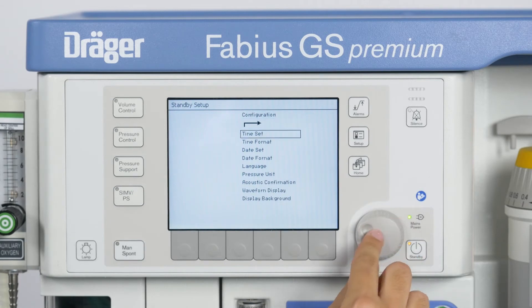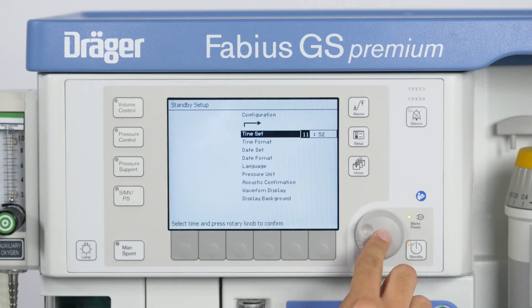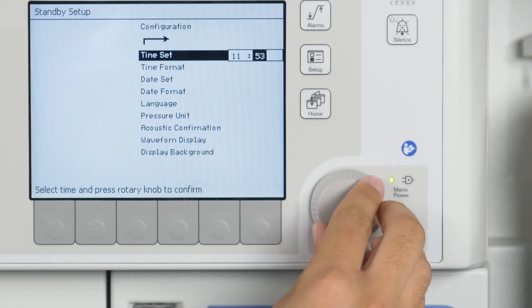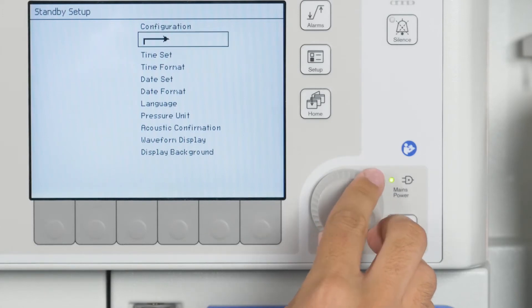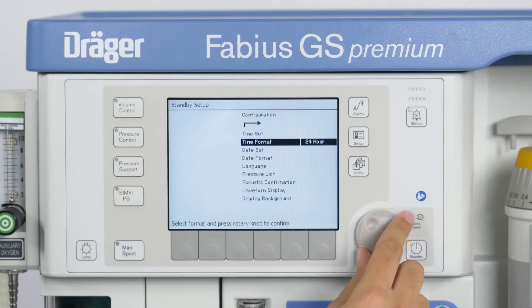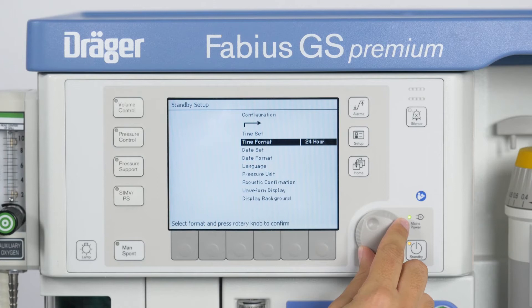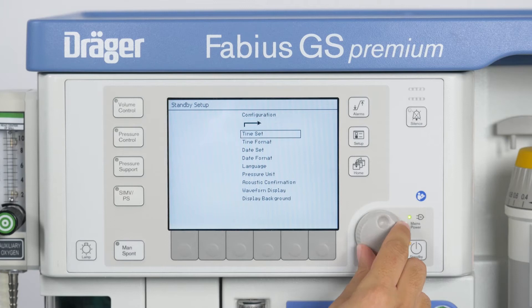The menu Time Set allows you to adjust the Fabius GS Premium's clock. Simply turn the rotary knob to change the values and press it to confirm. Under Time Format, you are able to choose between a 24-hour format and AM-PM as time format.